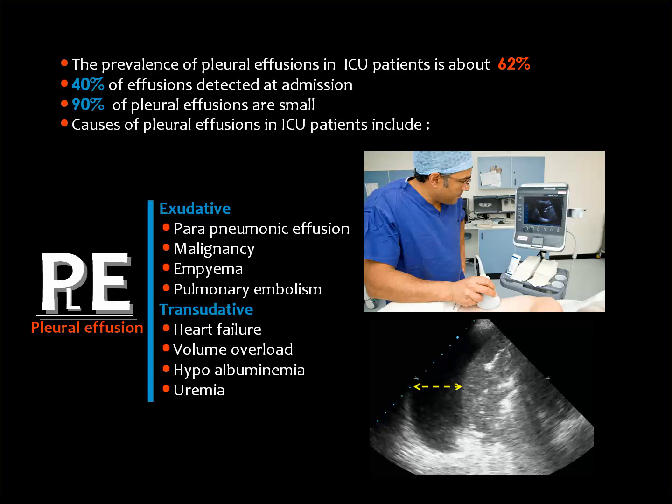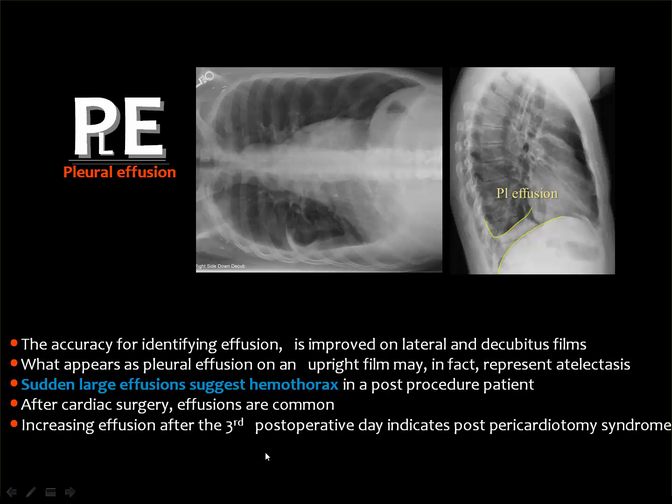Ultrasound is capable of diagnosing any pulmonary lesion or mediastinal pathology or pleural lesion, considering that the one who is holding the probe is efficient. And this will contribute much to the imaging of patients in the ICU, and may markedly decrease the need for CT.